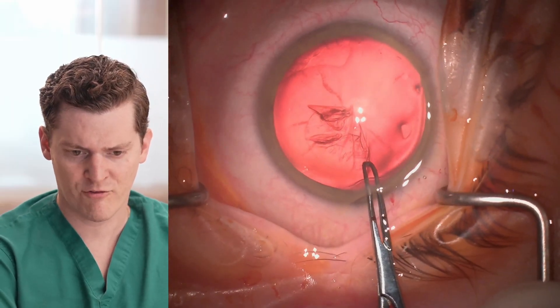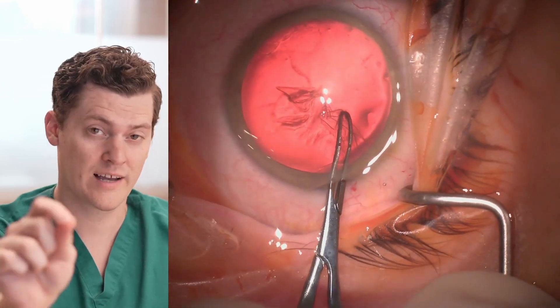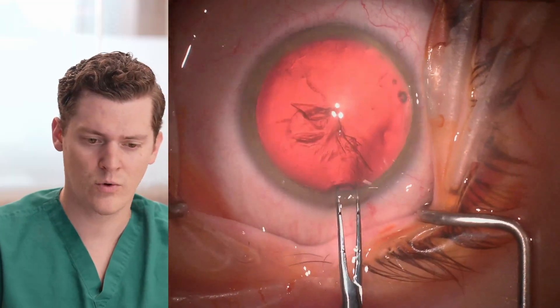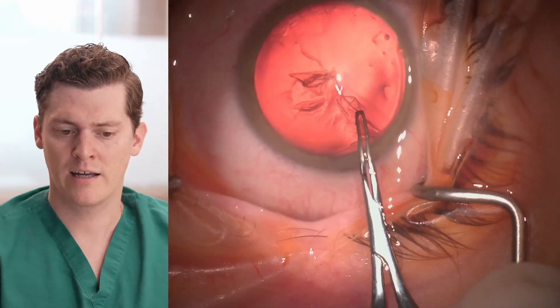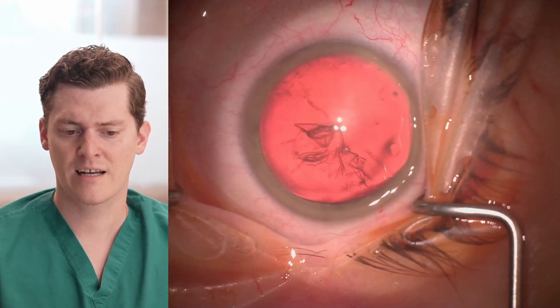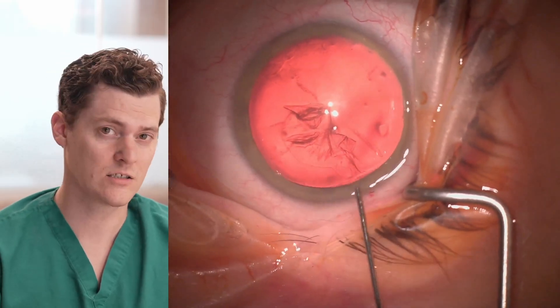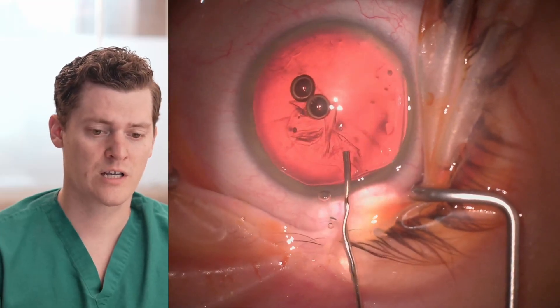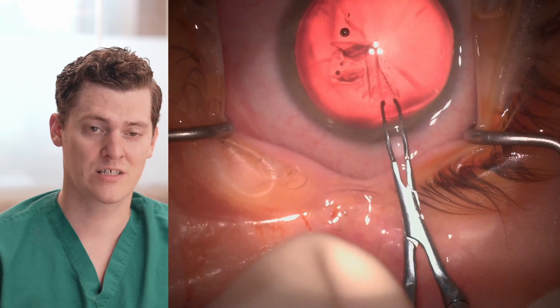Right here, instead of grabbing just the flap, I also grabbed the underlying capsule. When I do that and pull it like I normally extend a capsulorhexis, it just immediately dips out radially and extends. After looking at this more closely, I can actually see that it's starting to curve around — it doesn't look like it's going all the way to the equator or all the way posterior.